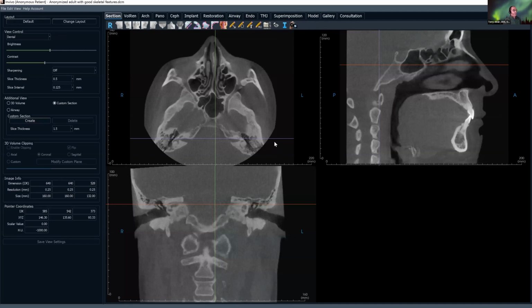And to familiarize you, if you're brand new to CBCT, almost all of the imaging software out there have this breakdown of the 3 anatomic planes. And I think they're pretty largely featured like this, although where they are on the panel may be a little bit different. This upper left panel demonstrates the axial view. And you can see the crosshairs, and the crosshairs represent the planes that you can scroll through.